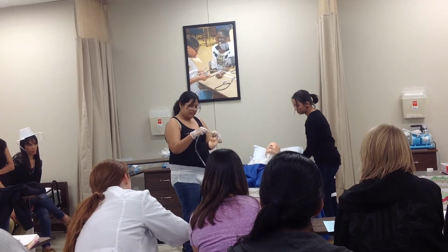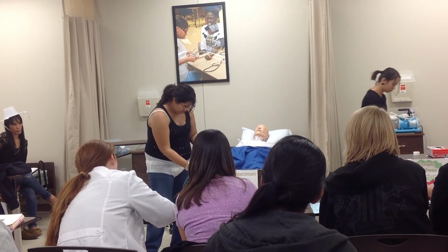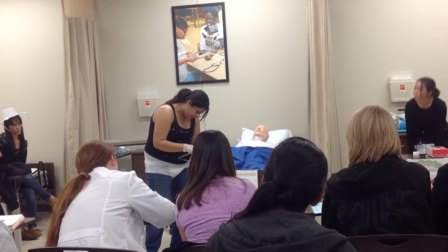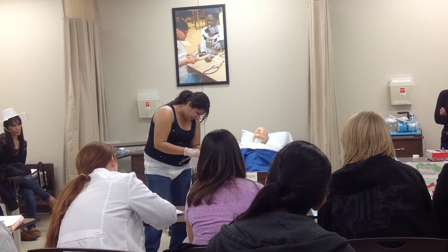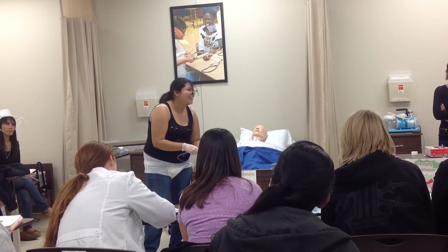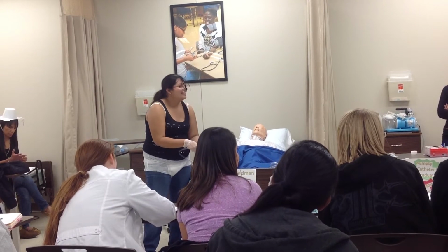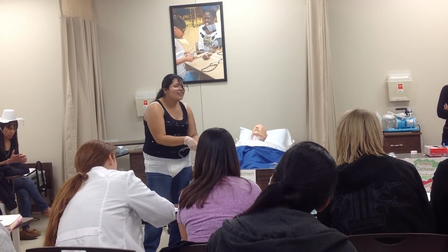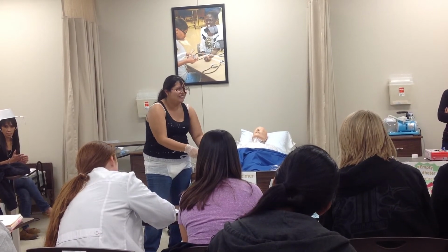And you're gonna just want to go ahead and connect that. It's not as easy as it looks. Look a little into here. See, people can do that. That's the only time you force something into a hole.